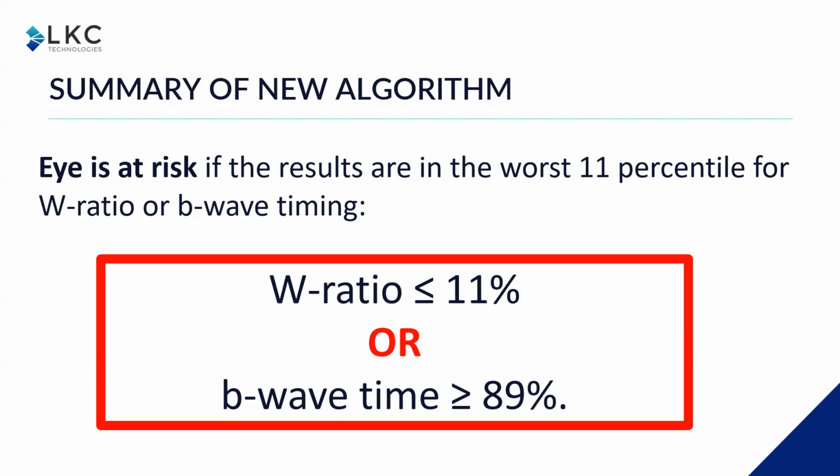Shortly, you will get an email from us with the link to the new firmware. Please convince your users to update it.